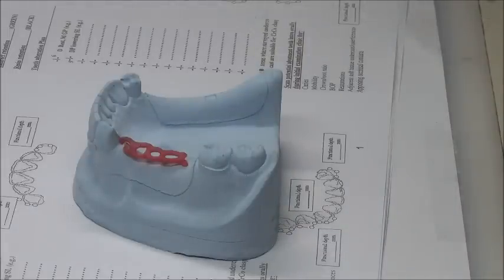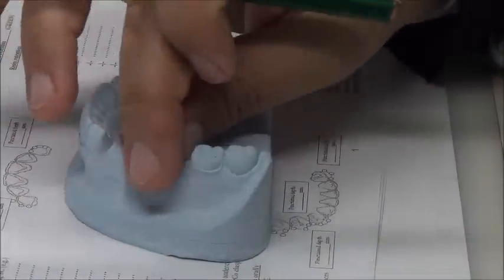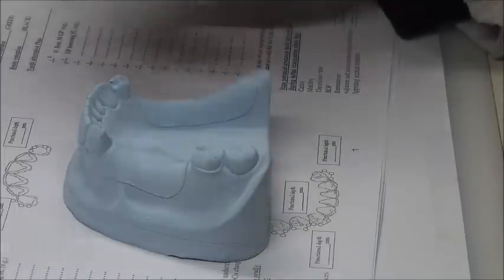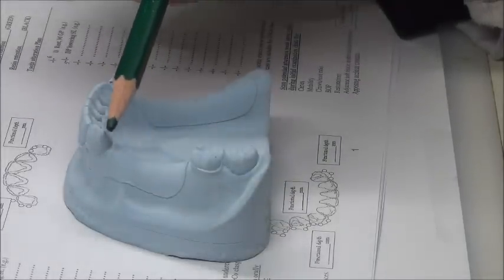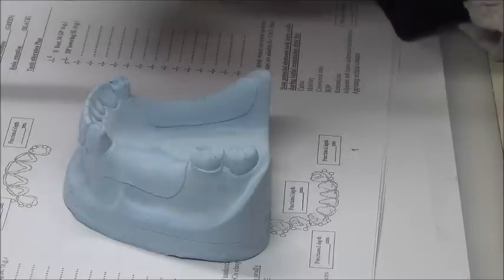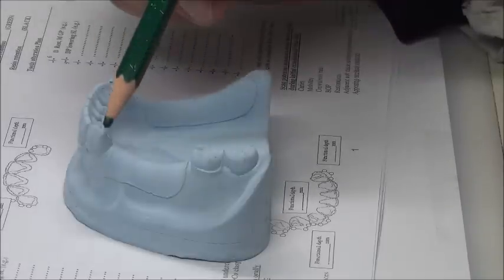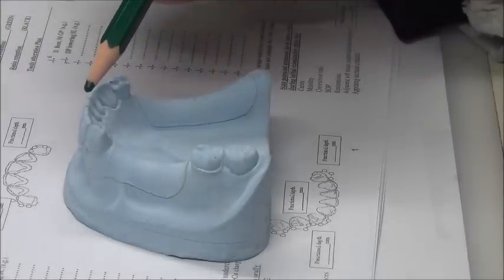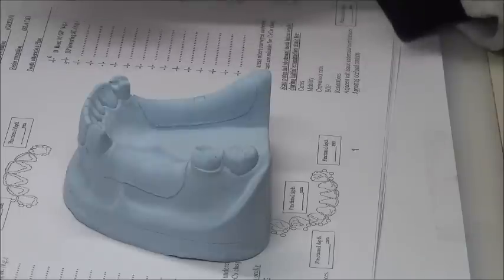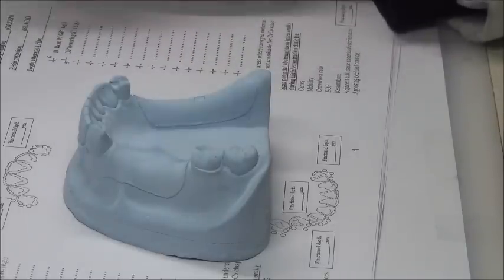Did we follow this design in our case? Remember the case where you did the wax-up. Did we follow this design? No, we did not do exactly like this. What did we do here? The Akers: did we change the Akers here? No, we didn't. Was it an Akers on the canine? Did we place an Akers clasp on the canine? No. I replaced the Akers with an I-bar. Why?